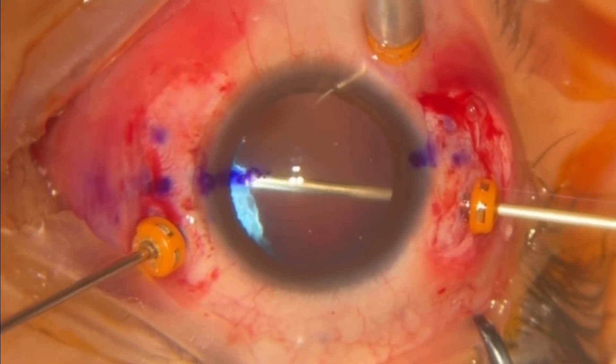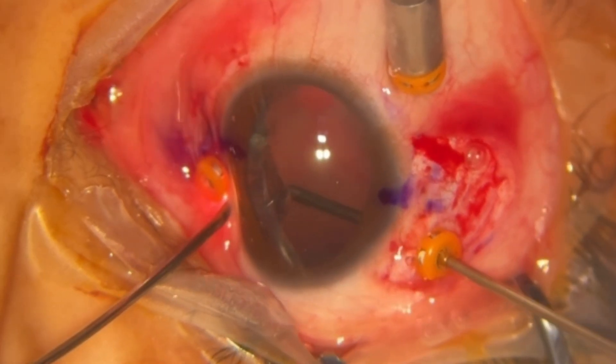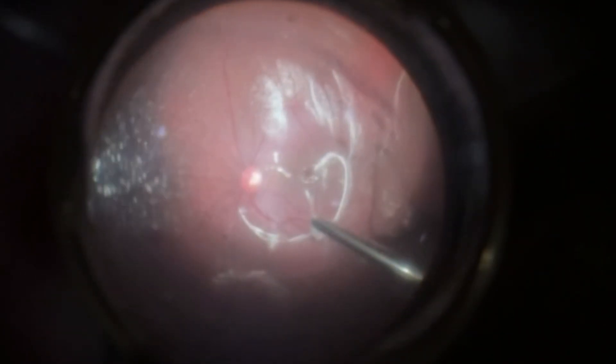Lensectomy is then performed via pars plana with the vitrector. A scleral indentation is made to ensure complete removal of the crystalline lens fragments. Core vitrectomy is performed, and triamcinolone is used to stain the posterior hyaloid.